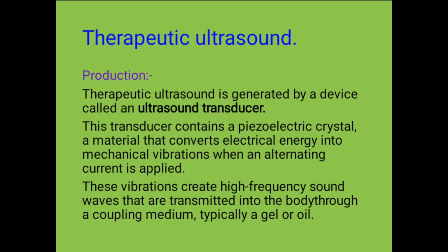And as I have explained, maybe let me mention a little bit on the piezoelectric effect. The piezoelectric effect is just a phenomenon in which there is a production of small electromotive force from a piezoelectric crystal when subjected to external pressure. Perhaps it might be when it is subjected to the alternating current. So basically, that is what we refer to by saying piezoelectric effect.